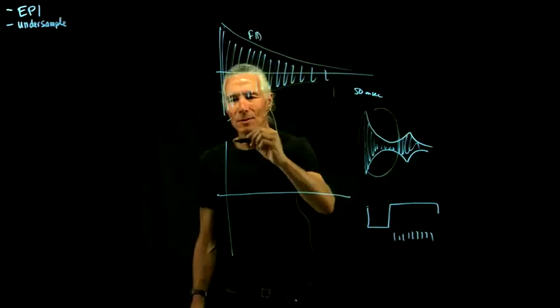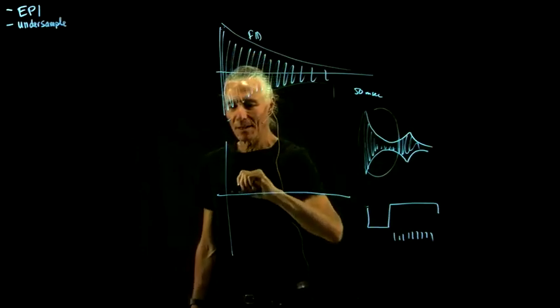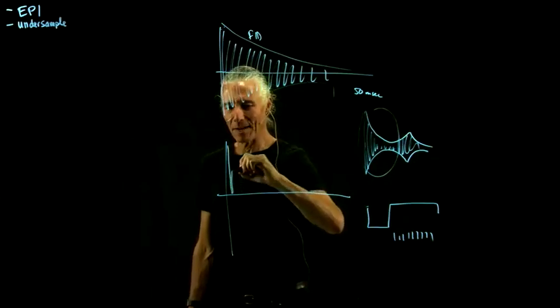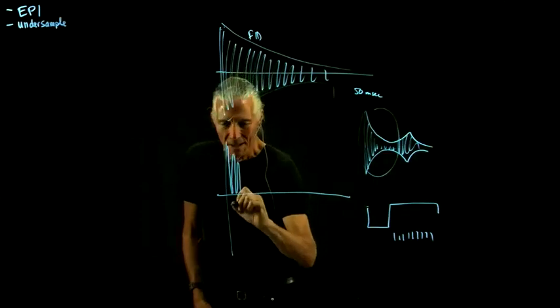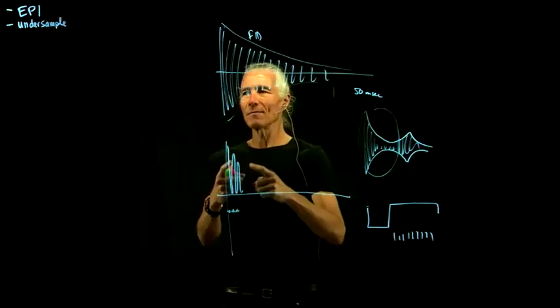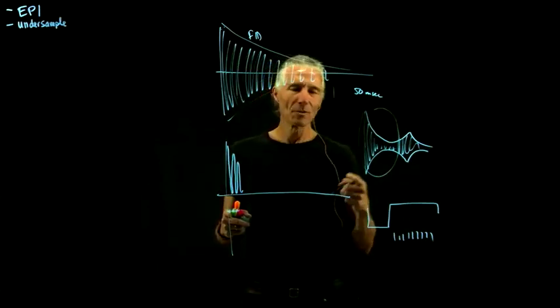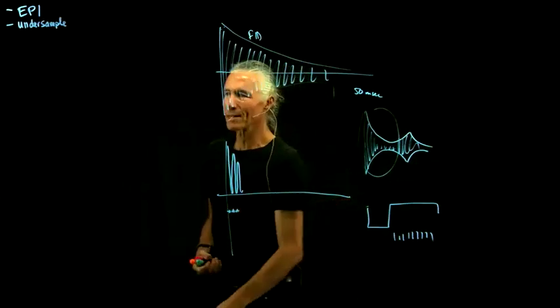As soon as the FID starts, we immediately slam the gradient on all the way, then reverse it the other way, and slam it on the other way, and reverse again. Each one of these makes an echo. So you're essentially collecting all of the echoes, like 64 echoes, that we need to collect all the k-space data for one slice.